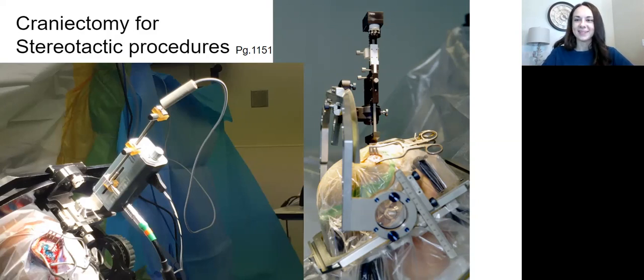So let's talk about these stereotactic procedures. First of all, this is what the frame looks like on the patient. The patient's head will be in pins, but it's a little bit different type of pinning. So it's a different type of pinning to accommodate this frame for the stereotactic procedure. So your stereotactic frame is going to be on page 1152.